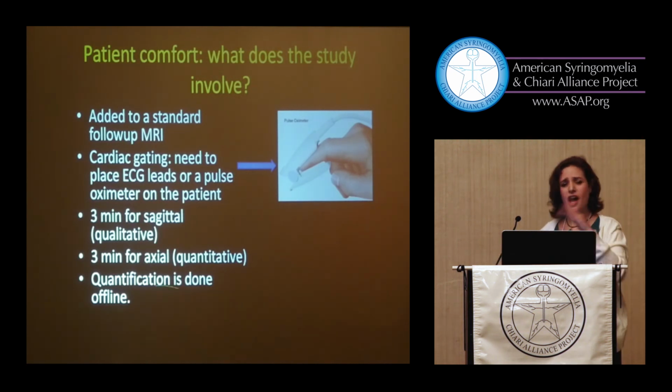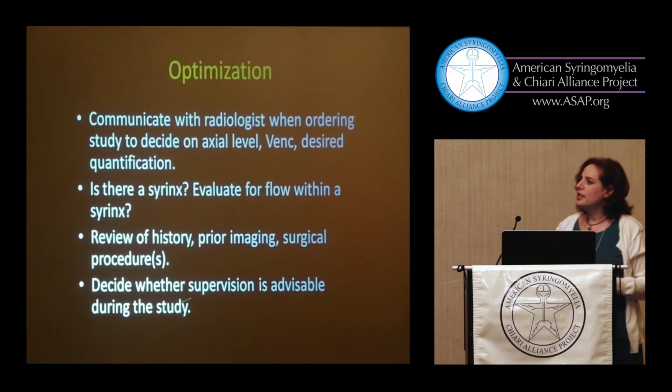The numbers we get offline. We don't leave you in the magnet while we sit there fiddling with our numbers. We do that when you're home already, okay? So it's not that invasive. It's a little bit inconvenient, but you're already there for the MRI, and frankly, all those other sequences are much, much worse in my opinion. They're louder too.